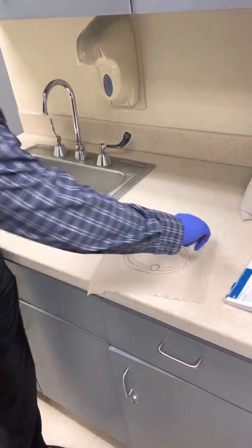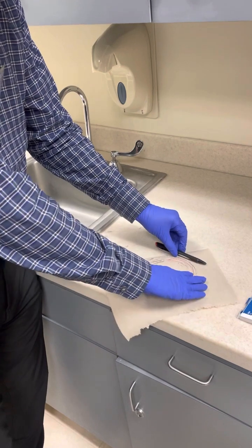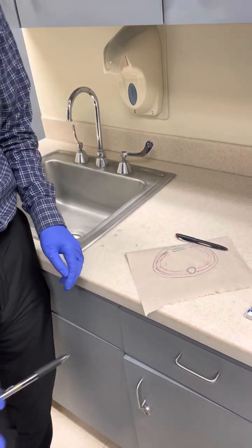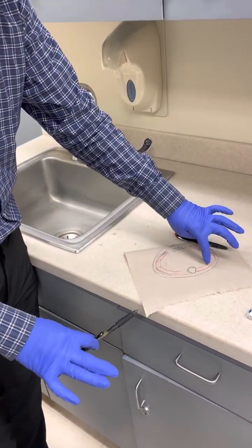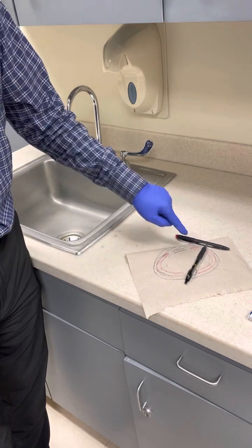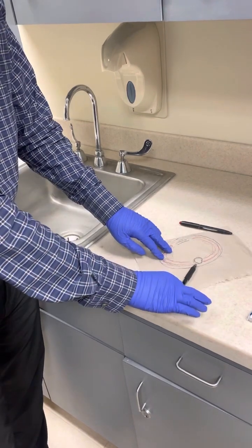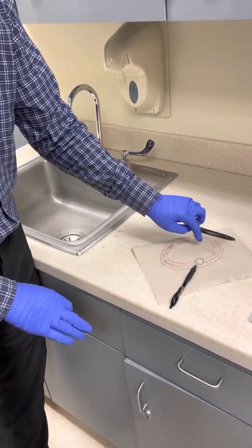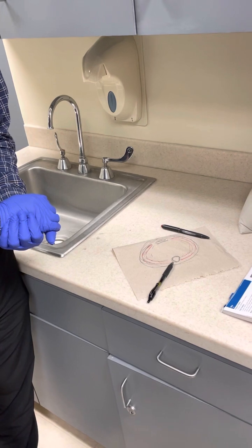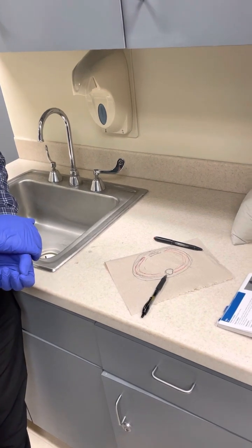Okay, so let's say that we have our IR, okay? And we said that our IR here, Mansi was in an RAO like this, correct? So, if the X-ray beam is coming this way, right? And it's coming through the patient's, which side is this? Right. Right side. So there's our X-ray beam. What do you see on top of these ribs? The spine. That's right. The spine is going to be projected on top of your right ribs. It's going to be superimposed on those right ribs. If you're looking at the right ribs, do you want the spine on top of them? No. So this position cannot be used to image the right ribs, right?